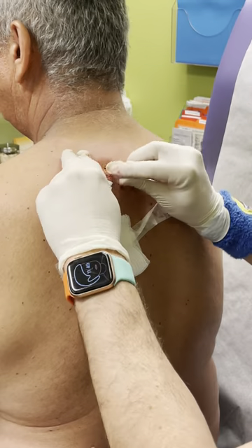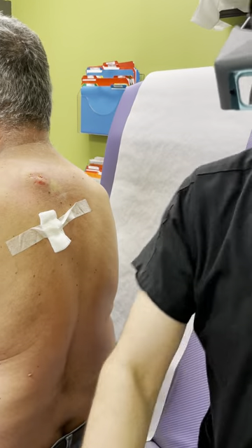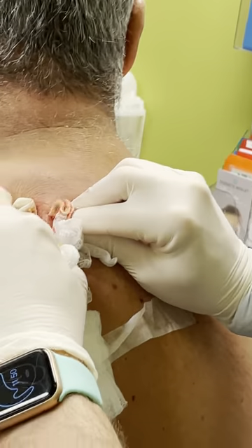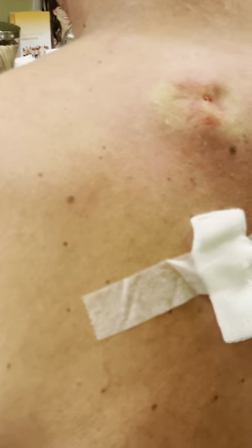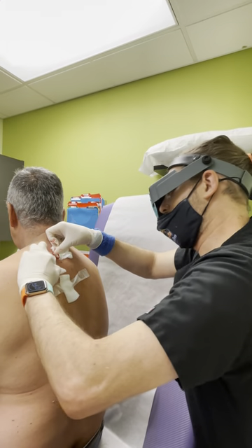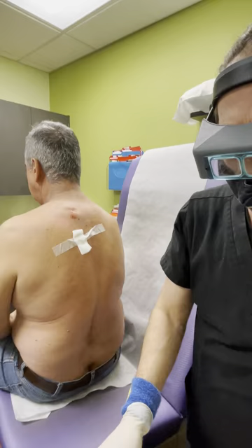Will it fill up? Maybe. If it does, you can squeeze it. If it's open, just squeeze it out. We're halfway home. Now it's to get the cyst wall. People are going to criticize us online — why didn't you get the sack? The problem is that's not the intent here. The intent here is to nick and drain it.